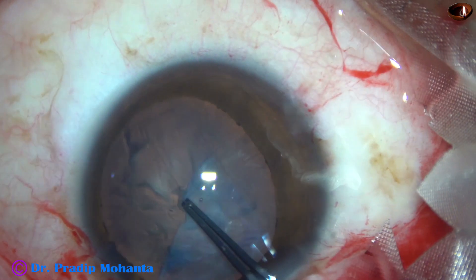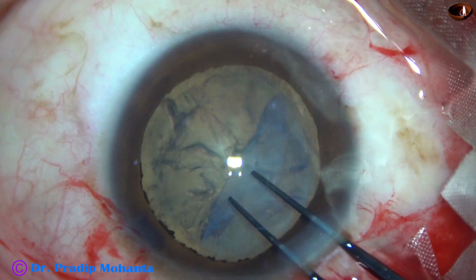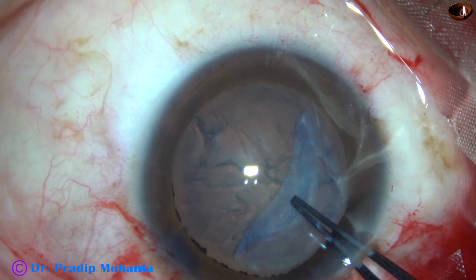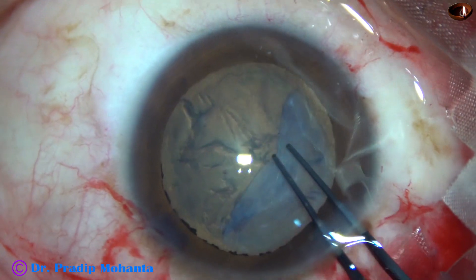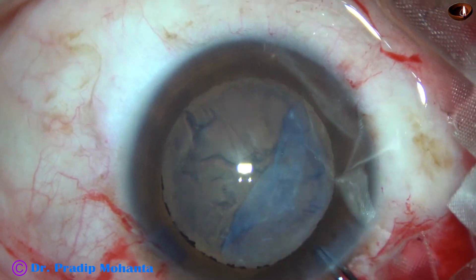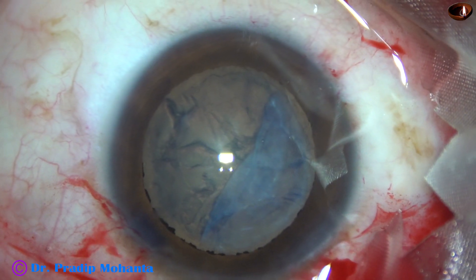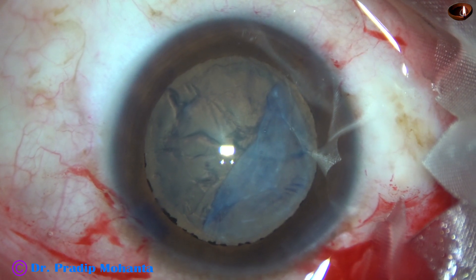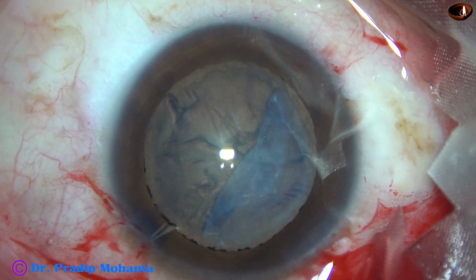As I pull here, I find that if I pull it vigorously the zonule will get torn. So I give off this side — but I'm not going to give up so easily, and I'm going to continue trying.